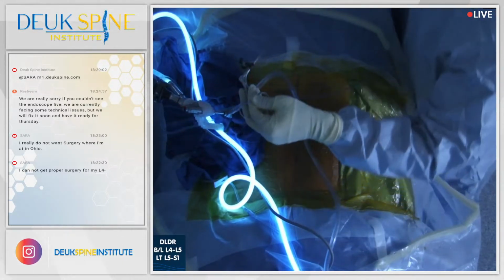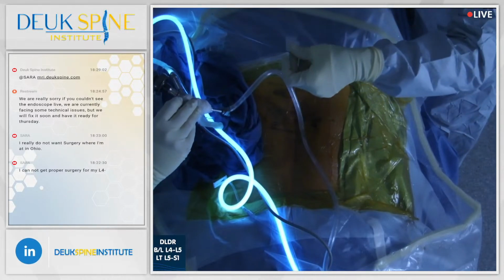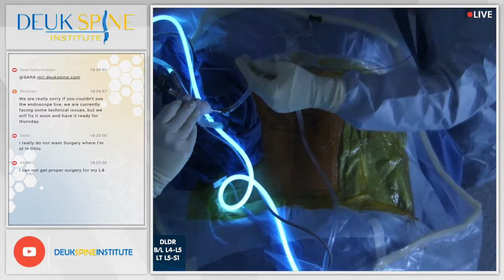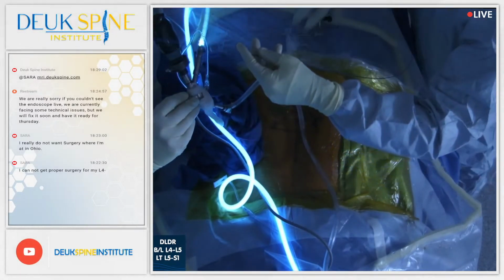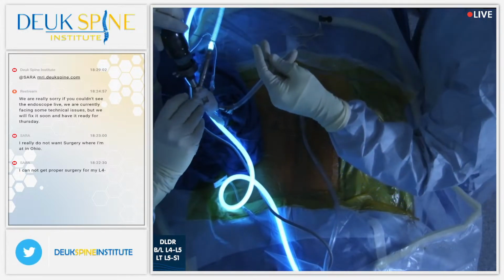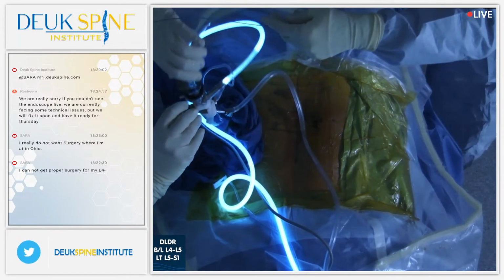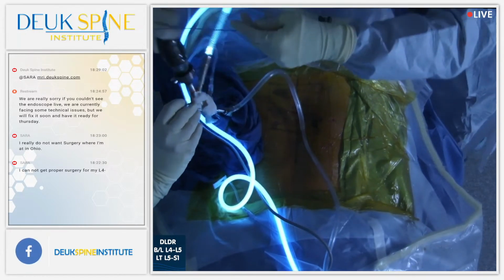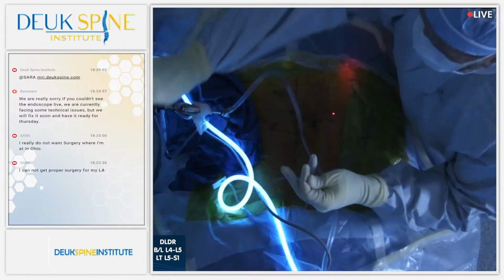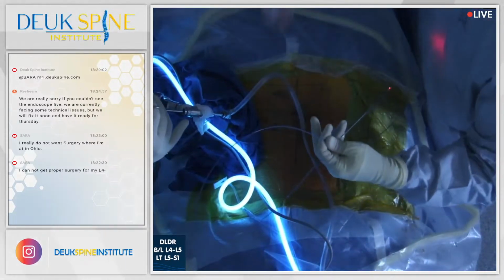Already fixed with that. Ready, please? Press ready on the screen. Yeah, no, you're good. You're all good. Thank you very much. How's irrigation?